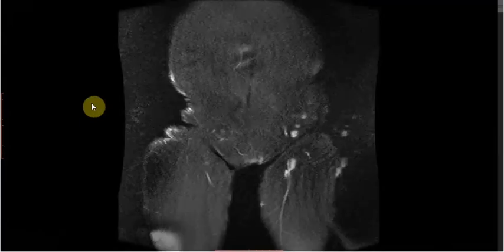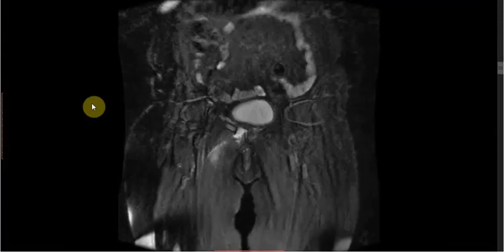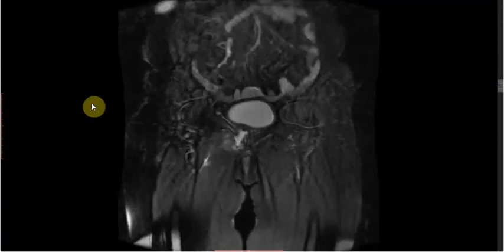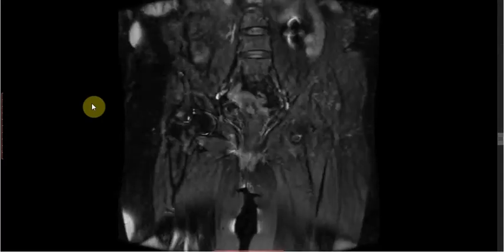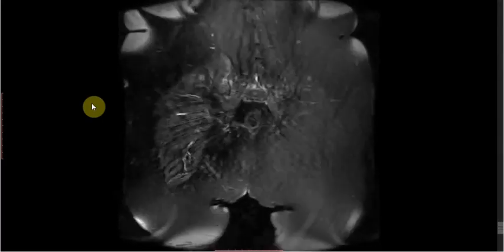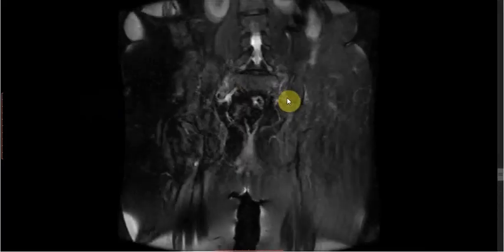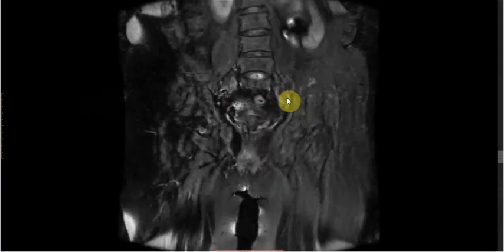Let's move to the next case. This is the case of a 65-year-old female who presented with difficulty in bearing weight and deep-seated pain in the lower back and in the pubic region. We can see there is presence of edema involving bilateral sacral ala, which is parallel to the bilateral sacroiliac joints.